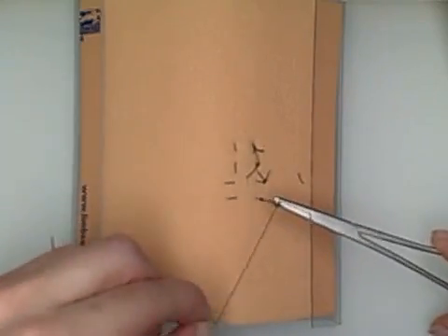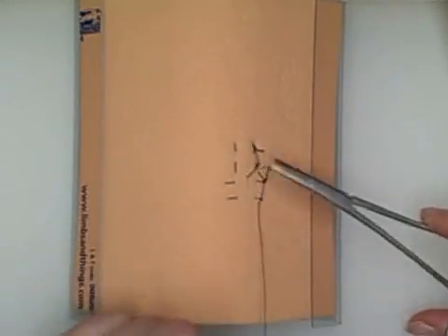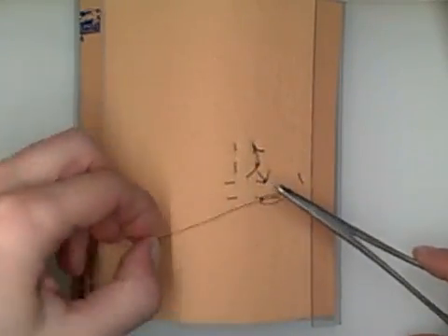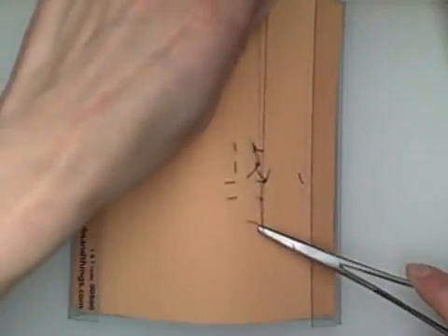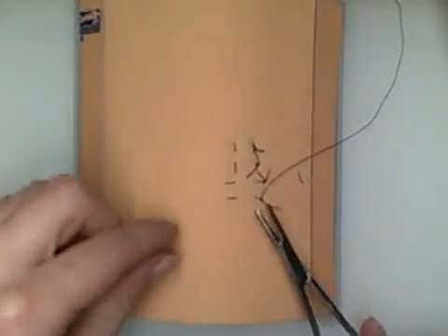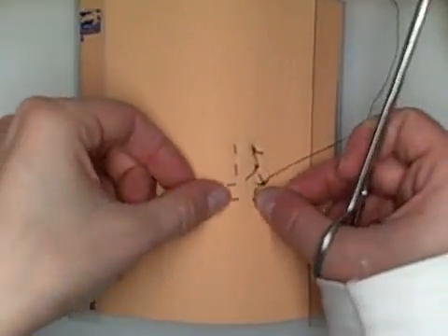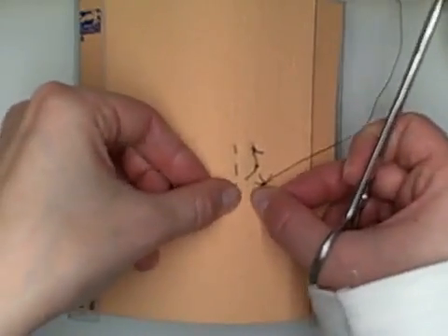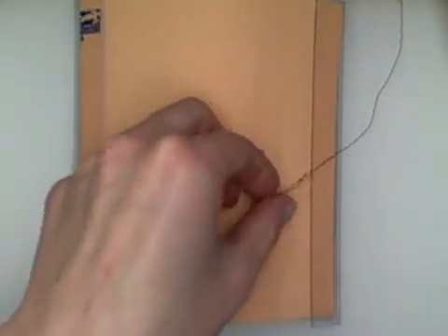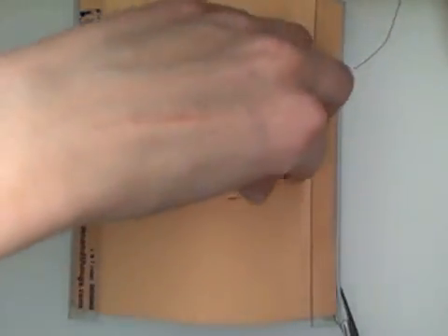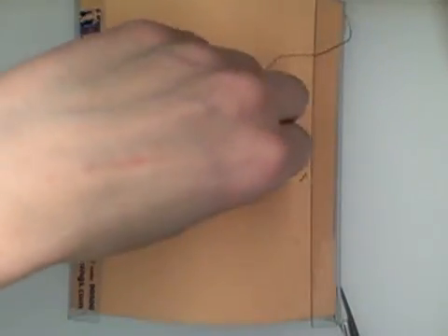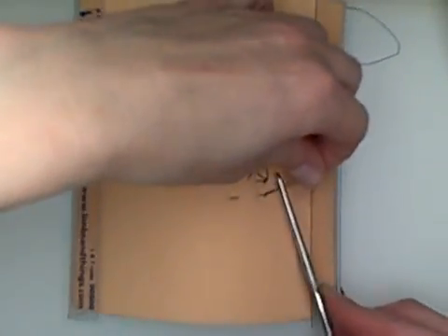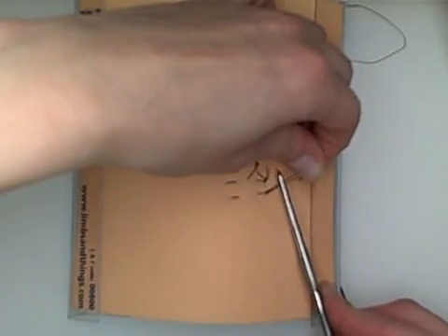When you're tying these knots, you don't want to pull too tight on the knot because that can cause a little bit more eversion than you want. So if I were to pull too tight on this, it might cause a little bit tighter and ultimately it would cause a nasty little scar. So let's cut those.